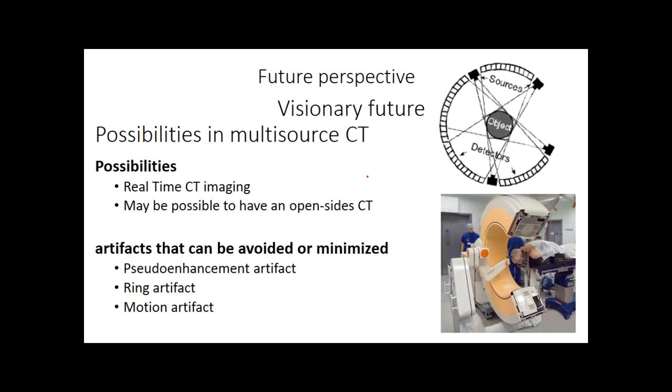Now, that was the current future. The visionary future, what we should imagine to happen in the future, is the multi-source CT with a possibility of real-time CT imaging. So there is no waiting time. It will look like fluoroscopy.